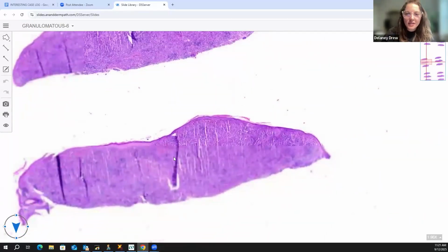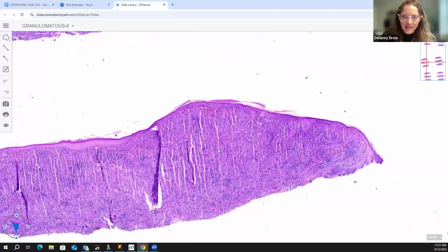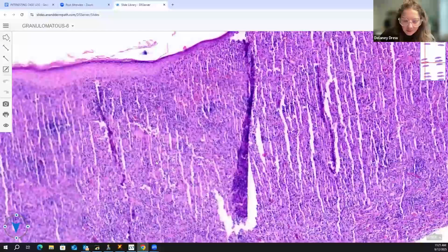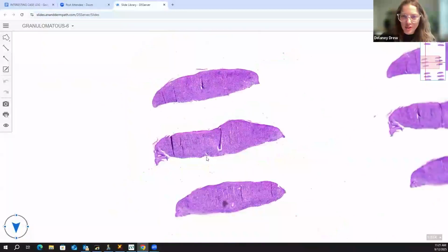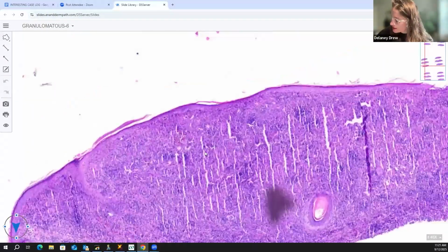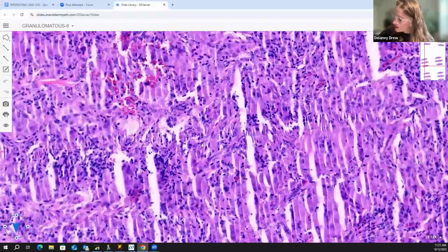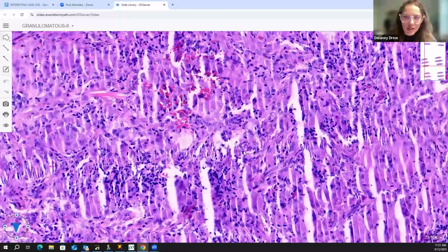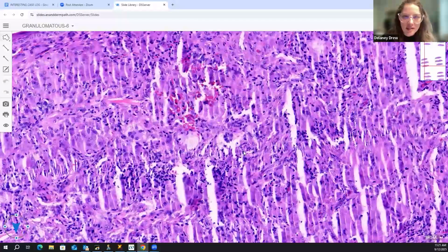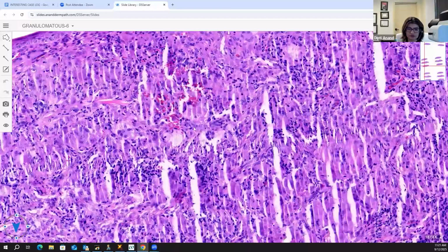I can take this one. Okay. So we have areas of both light pink, which are histiocytes, and dark blue, which are lymphocytes. And so I called this Rosai-Dorfman, and if you look in the pink, you should be able to see some cells. What do you think this cell is right here?